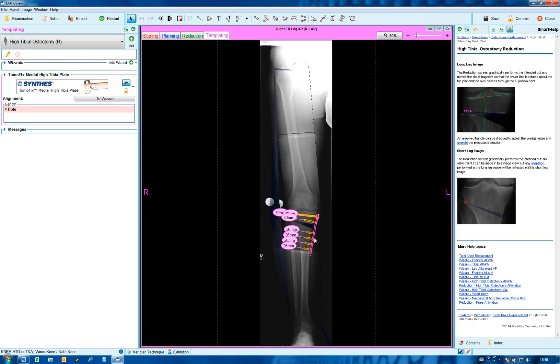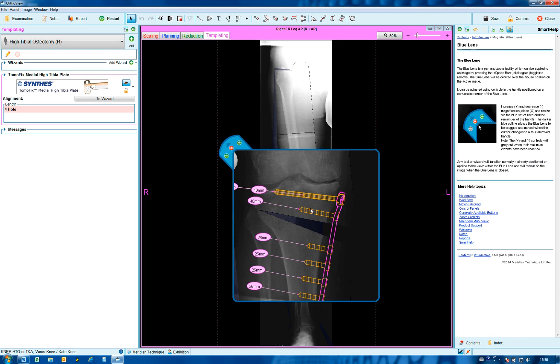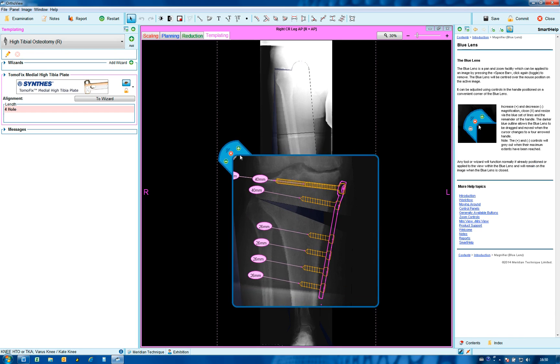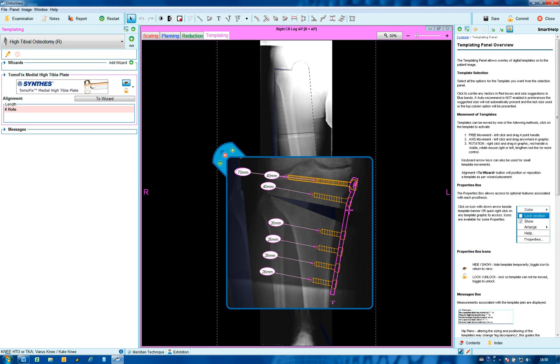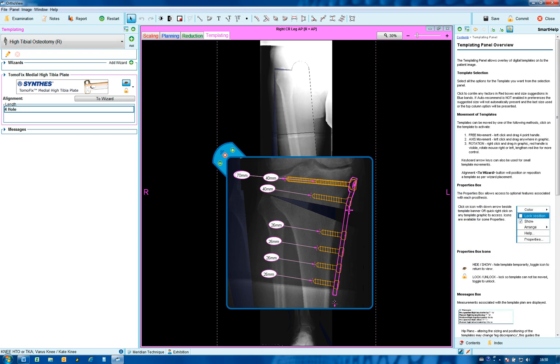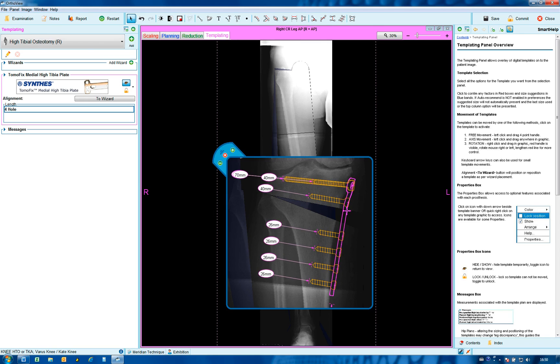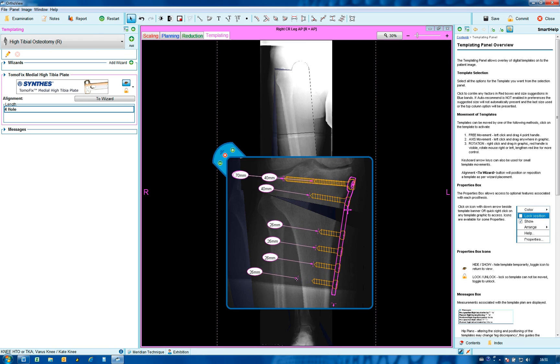When happy with the position, move to templating. The template will appear in roughly the correct position — it may need some adjustment and screw sizes will need to be altered using the blue lens magnifier. Use the control handle at the bottom to adjust for rotation, and the four-point handle to adjust side to side or up and down. Adjust screws as needed.